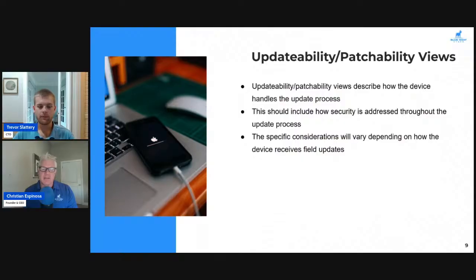Yeah, and I guess it doesn't have to be USB. It could be Bluetooth or some other mechanism as well for a physical update. I know one of our clients in the past used software that did whitelisting of what type and what manufacturer of USB drive could be put into the device for the updates. That was their solution. I don't know if that's the most effective because there's a lot of overhead in the device, but that's what they came up with.